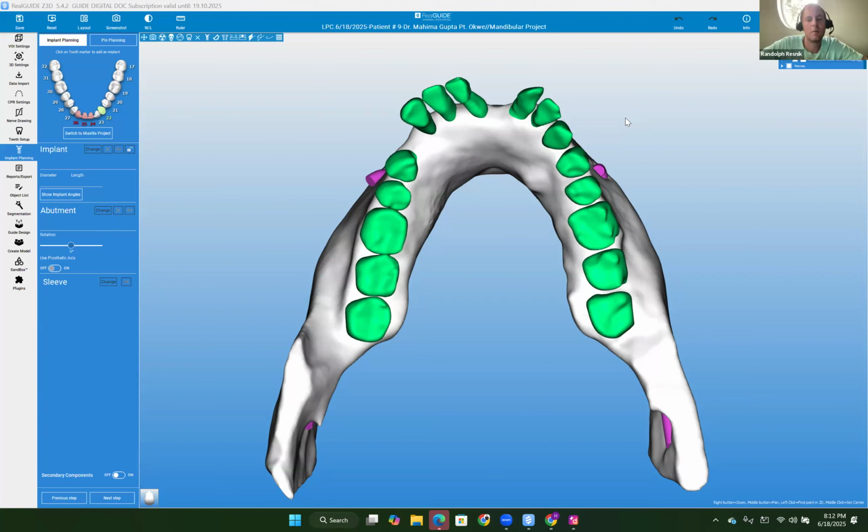Okay. So what I did, I extracted those anterior teeth because it was so difficult to plan the implant. You did take them out. Okay, perfect. So I already extracted the teeth and I made the partial denture for the patient, and I put the radiographic marker on the partial denture and submitted another CBCT. Okay, so we just don't have that, so we'll take a look at that, and they'll send it over to myself or my father, and then we'll look at it there.